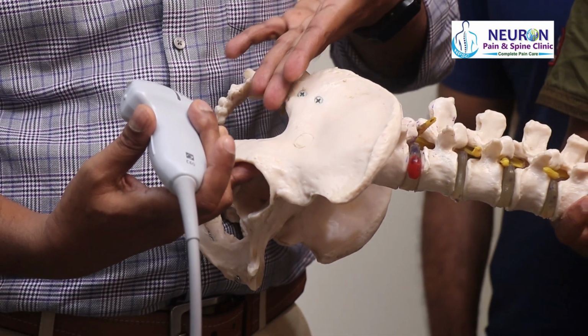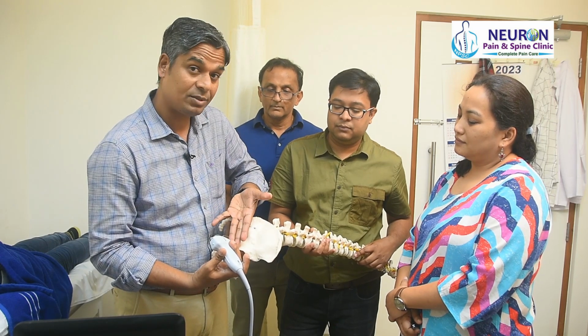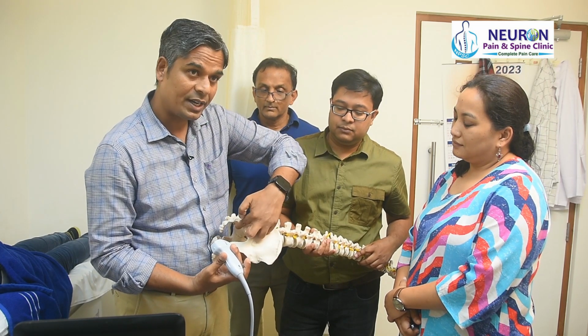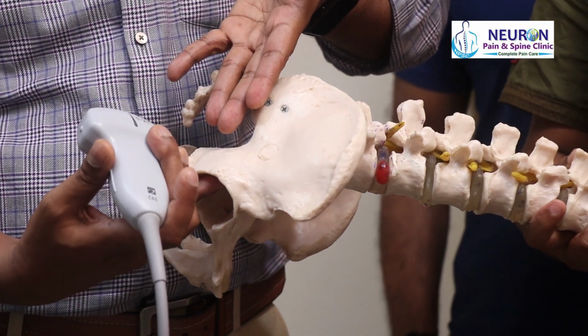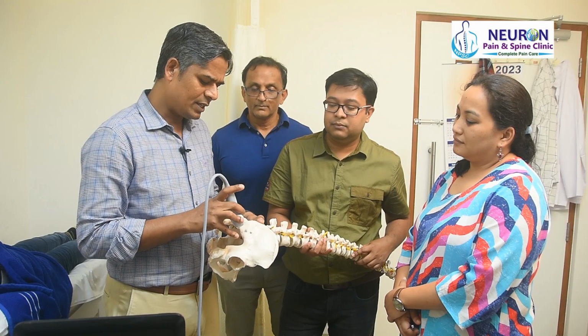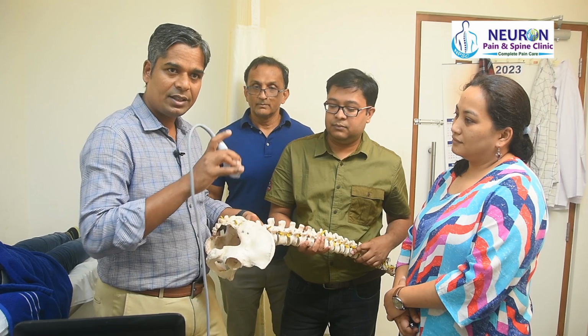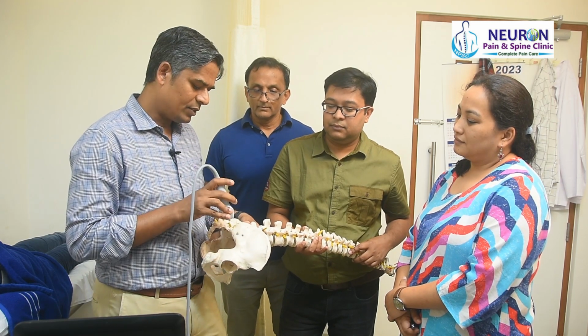The piriformis muscle is a little obliquely oriented, not in this transverse plane. Keep this in mind. From S2-3 anteriorly, it occupies the whole of that greater sciatic foramen and goes into the greater trochanter. So once I reach this area, the greater sciatic notch, which one can appreciate as a break in that bone hyperechoic line, then I do certain things.